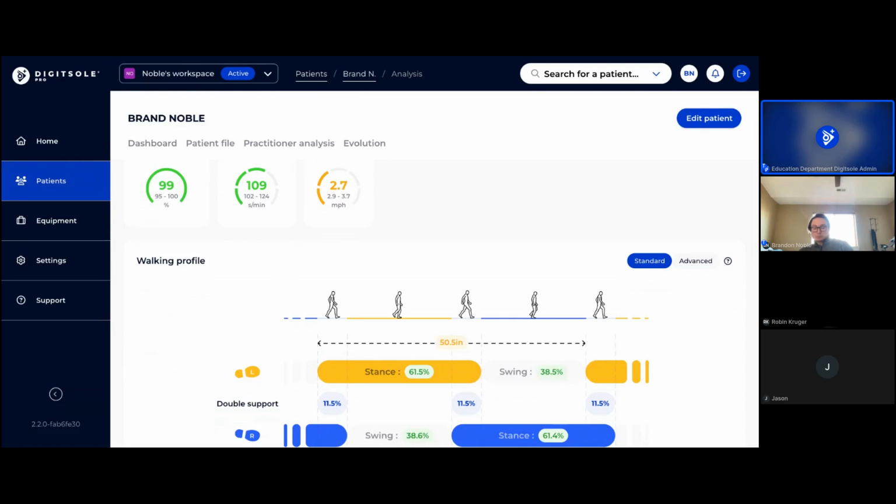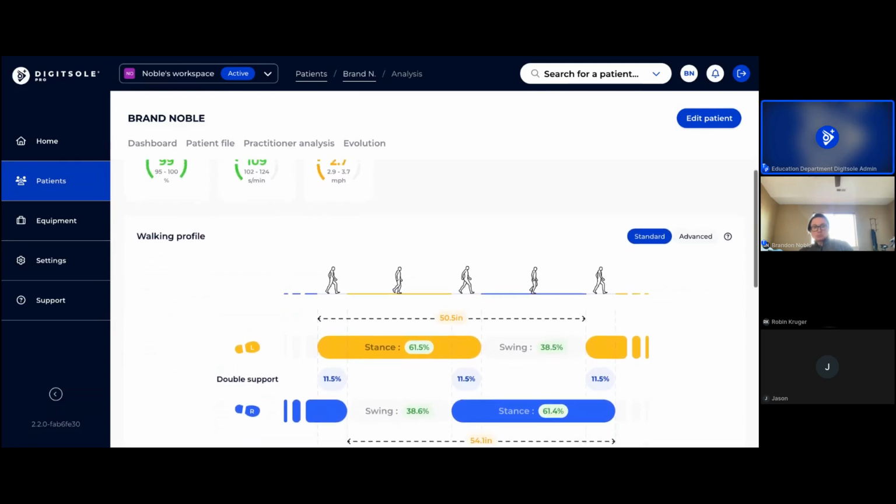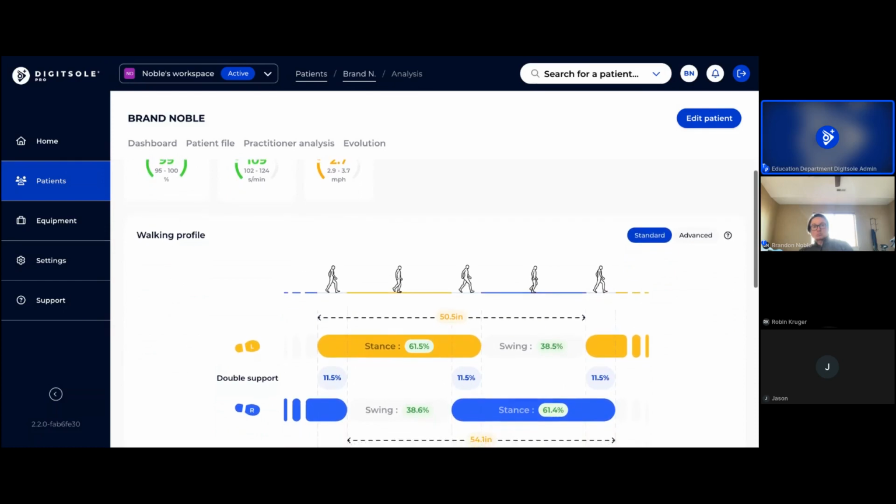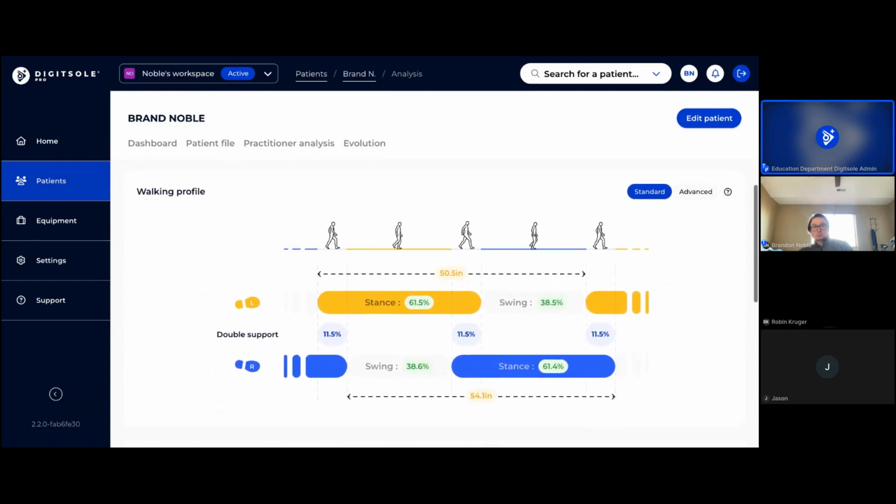And that's why, for me, this hits home with people, because walking is supposed to be something really simple, basic, that we're all familiar with. And actually, they're supposed to be able to accomplish it at a specific speed. So just knowing that they're lower than that, and what we find is this 2.7, they're on the low end. And the problem will be if they started to walk even slower, once you hit below 2.4, you're actually looking at a real difference in morbidity and mortality. So, obviously I don't say that to patients, but I say that's a problem that we want to make sure that we address.